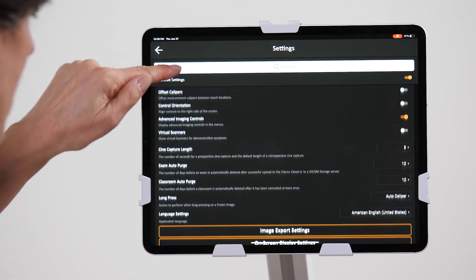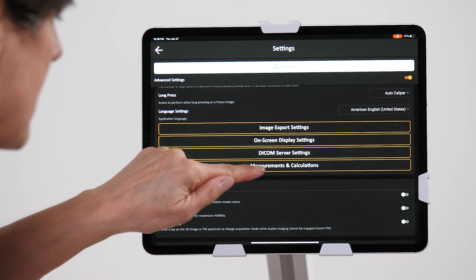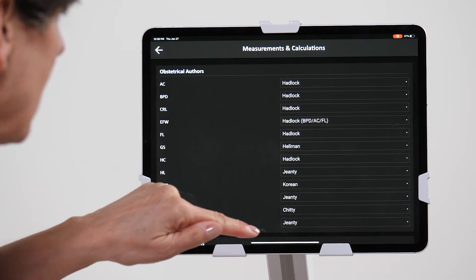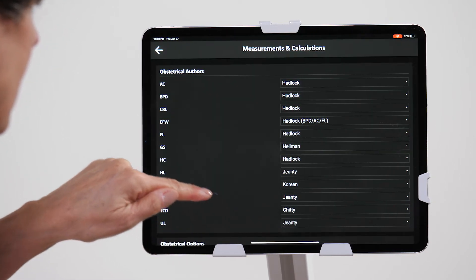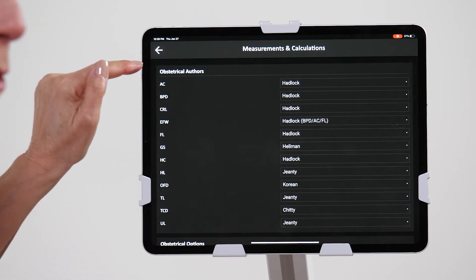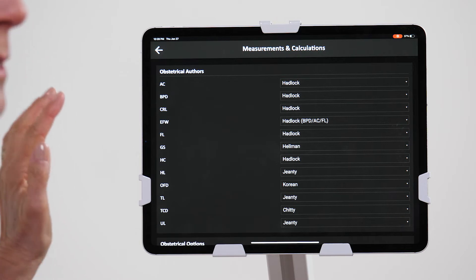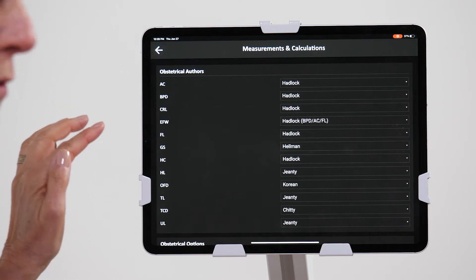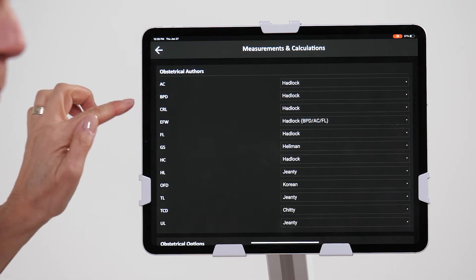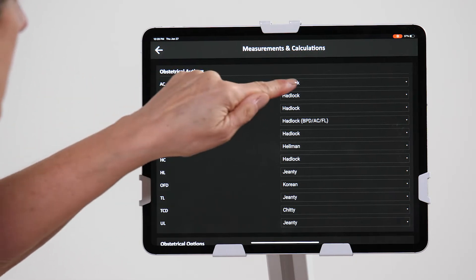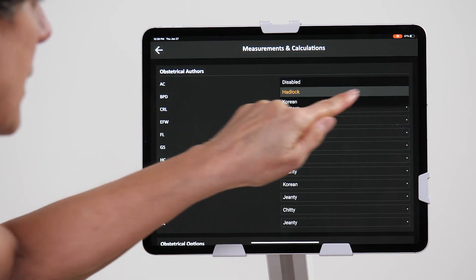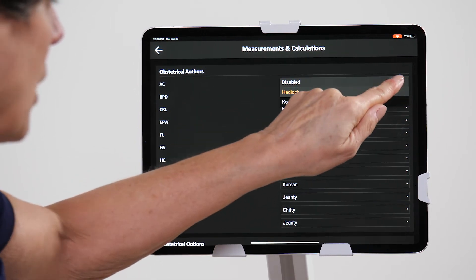We're going to scroll up to measurements and calculations, and here we're going to see obstetrical authors. Now we have the ability to select different authors for the different measurement packages. Just by hitting the drop down menu, you can select different authors.